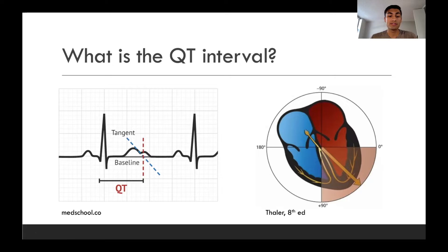But a commonly accepted way is through a method called tracing the tangent. And if we draw a tangent line on the end of the T wave, the point where it intersects with the baseline, that is essentially the endpoint for the QT interval. And what the QT interval is demonstrating is the cycle of depolarization and repolarization of the ventricles. And in a normal EKG, the QT interval should comprise just less than half of the total cycle, about 40%.